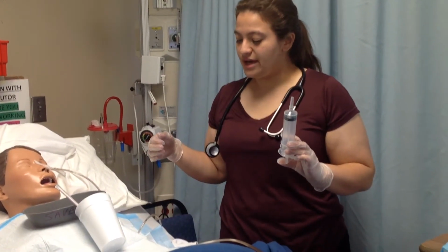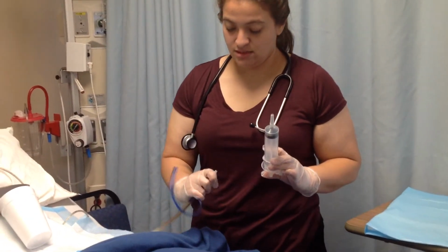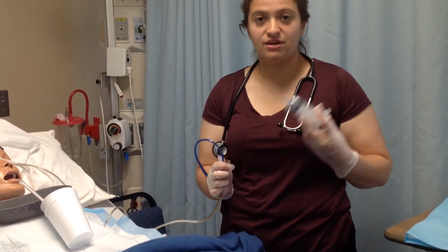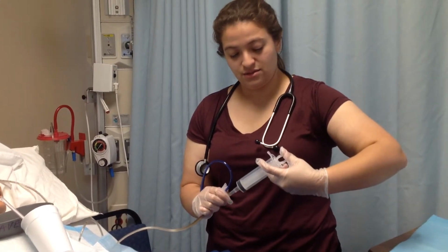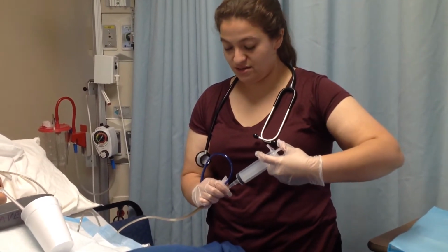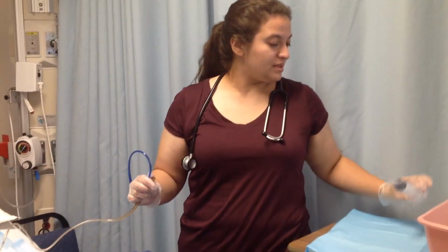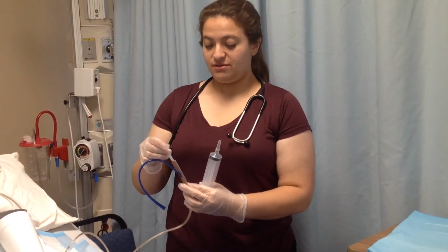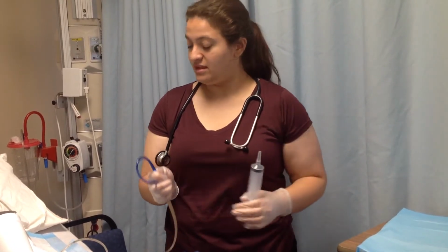And then I would go ahead and uncap this, and I would make sure to put the stomach contents back into the tubing. So just put in whatever remainder there is. And then I would put my syringe and just hold on to it. And I would put this back in there and clamp it back up.